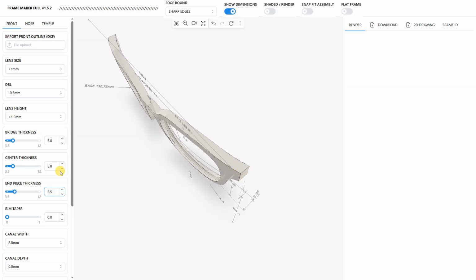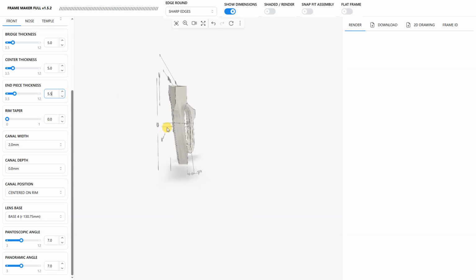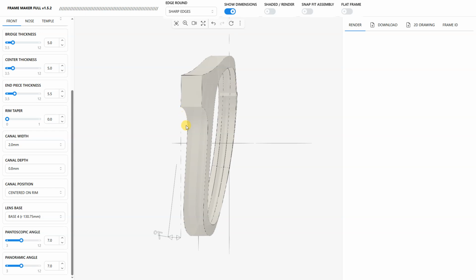That's 5.5 there. Now, rim taper is something that I added more recently, and it's how, when I view the frame from the left or from the side, the rim thickness that goes from 5.5 up here tapers down to slim down to the bottom part. Now, this is radius, so this is pretty new. I should clarify that. So let's say I want a 0.6 degree, it's an angle. I'm going to angle this back part.